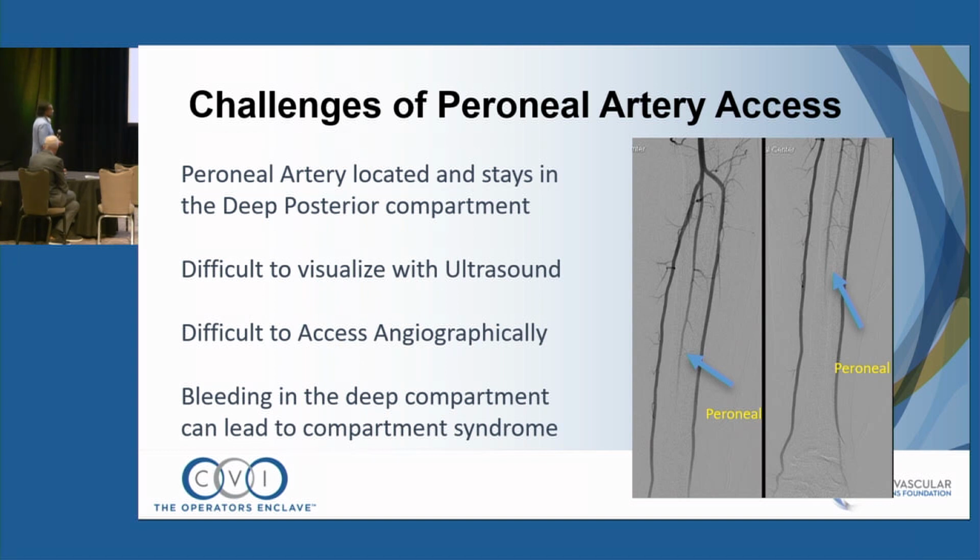And basically what you're going to do is you're going to just go orthogonal over and over and over until you get it. You're going to advance it, then you're going to go orthogonal. And usually these vessels are going to be pretty heavily calcified, and so really you're not going to necessarily need to keep doing angiograms. You can just follow the calcium. But sometimes if they're not heavily calcified, then you will just have to do injections. Unfortunately, it is what it is until you get access.